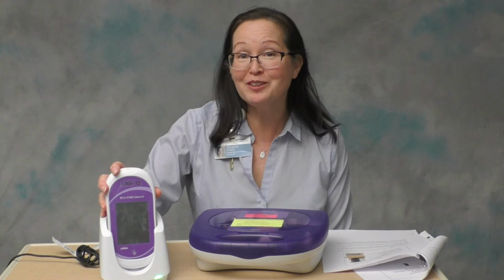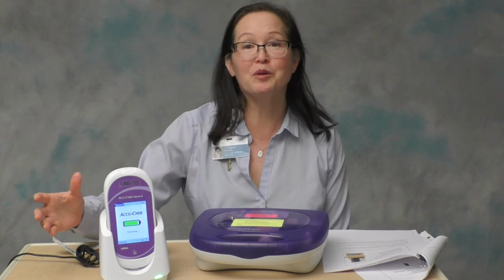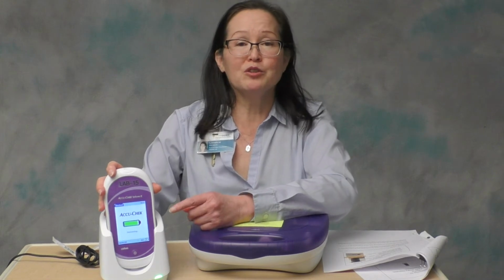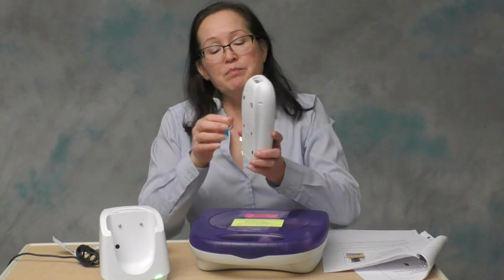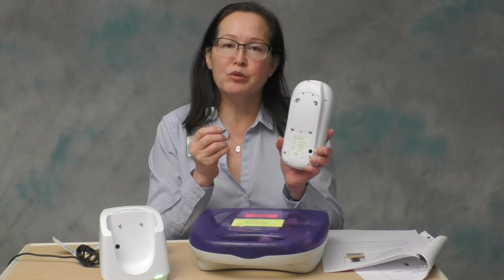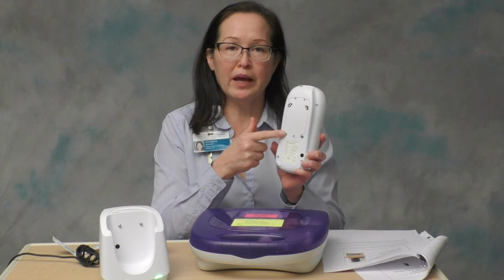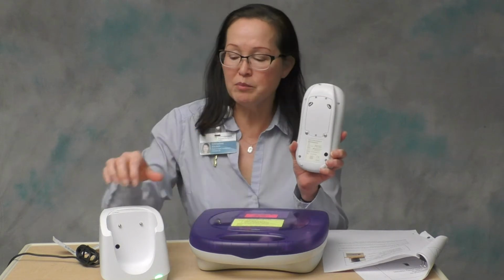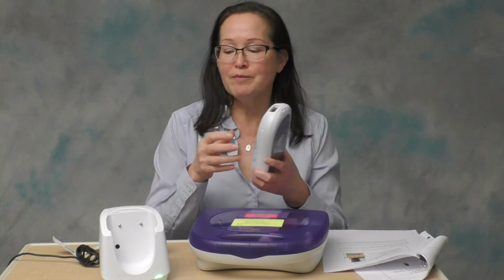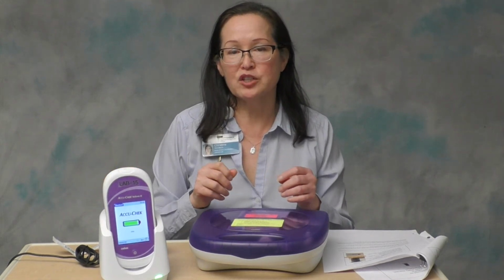Sometimes you have to jiggle it around a little bit, redock it a couple of times, try it in another base. Sometimes they get particular about which base they can connect in correctly. So just don't walk away from it until you know that it's docked. These battery contacts, when they get cleaned, the bleach residue can leave a fine powdery film on them, and sometimes that prevents a good contact from being made. So you can take an alcohol prep pad and rub it on the battery contacts, both on the meter and on the base, to remove the bleach residue, and make sure you dry it, redock it, and 90% of the time that will improve the connection.